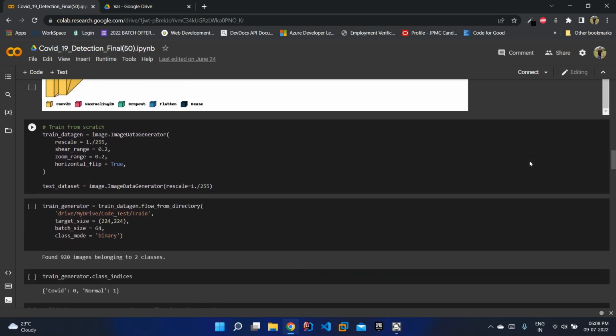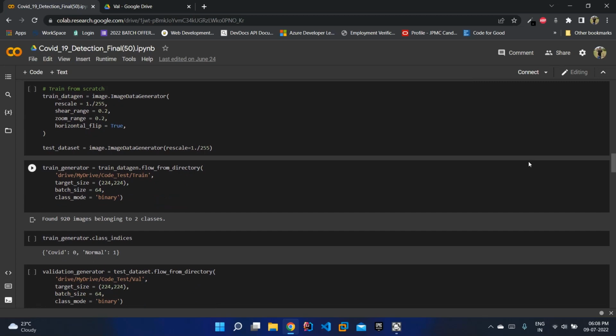We then moved on to provide our model with its training and validation data. It is important to understand that a CNN model can be fed data only by means of constructing a pipeline which can then talk to the built model. We constructed a train data generator which essentially took the images that we had stored in the train folder and rescaled them by 1/255, or 1 over the entire RGB space.